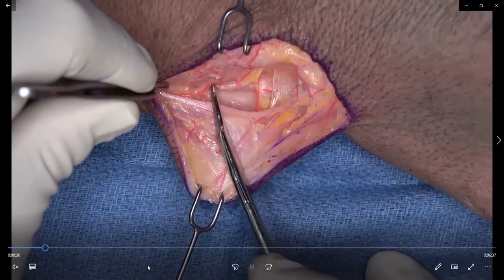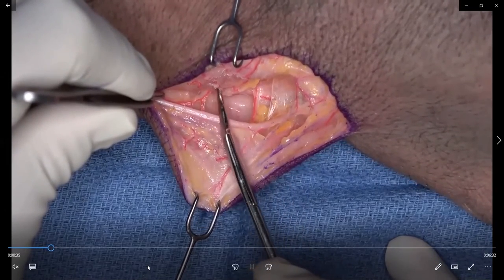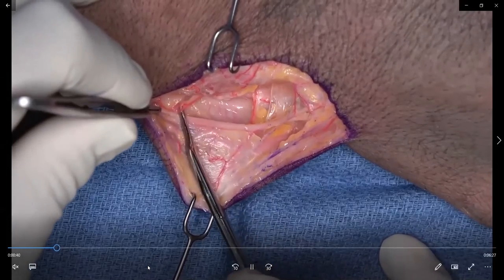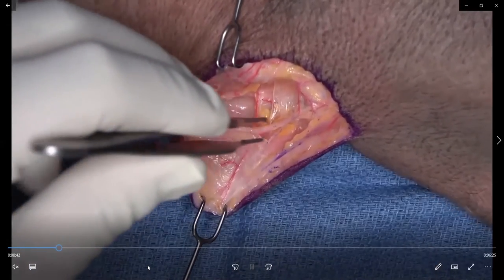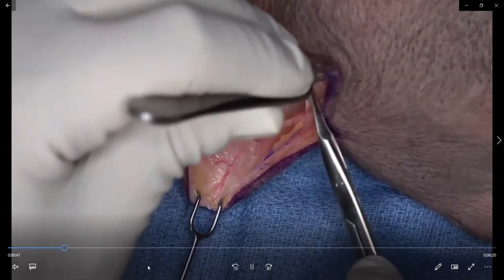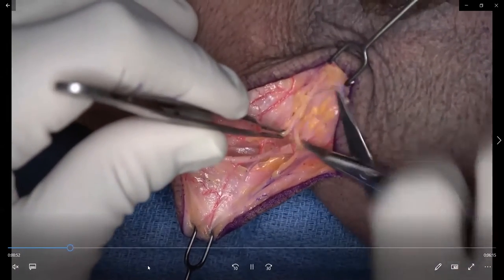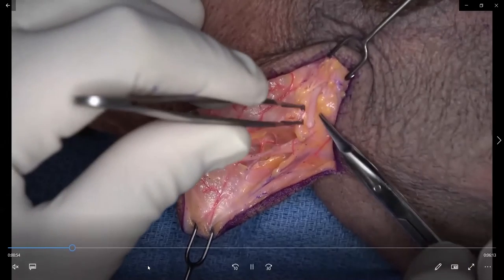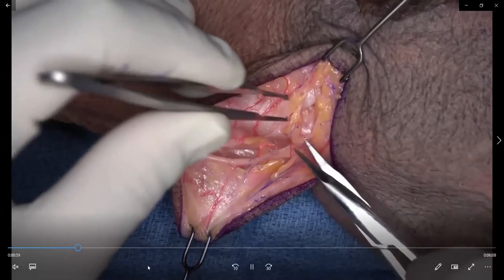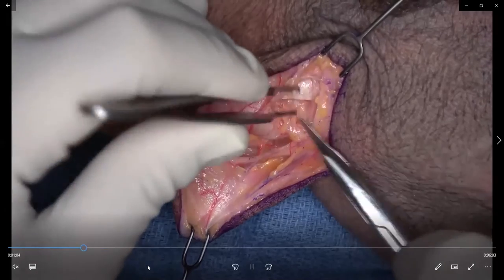The scissors are depicting the 1-2 pedicle, which sits directly over the retinaculum between the first and second extensor compartments. It's quite superficial. Most of us like to not exsanguinate these with an Esmarch prior to elevating the tourniquet — just elevate the extremity and apply a little manual compression so you have some blood in these vessels when dissecting. That helps you not miss those vessels, because they can sometimes be half a millimeter or smaller.